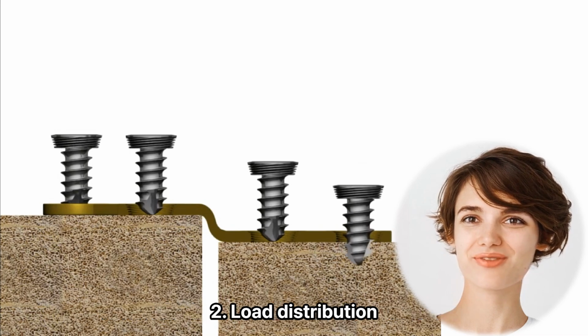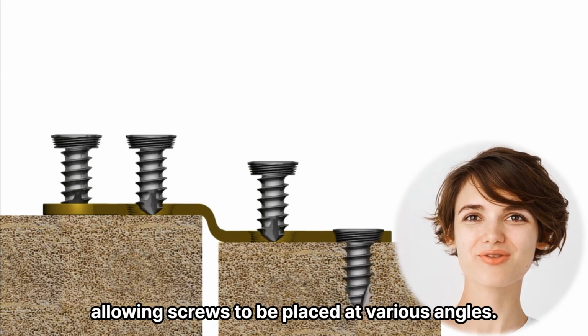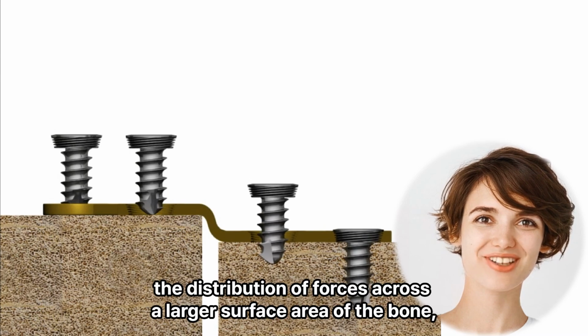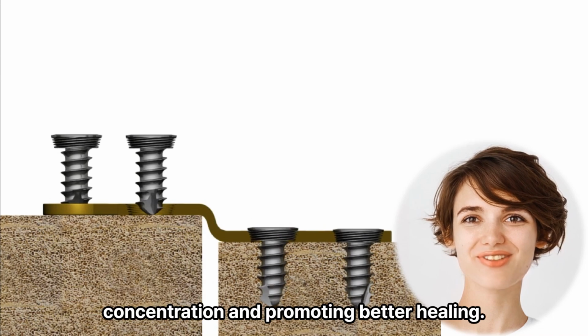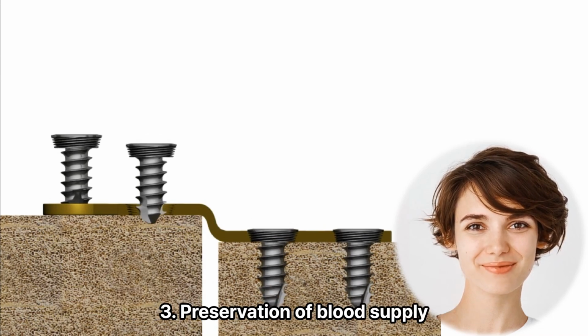2. Load distribution. Locking plates have multiple holes along their length, allowing screws to be placed at various angles. This enables the distribution of forces across a larger surface area of the bone, reducing stress concentration and promoting better healing.